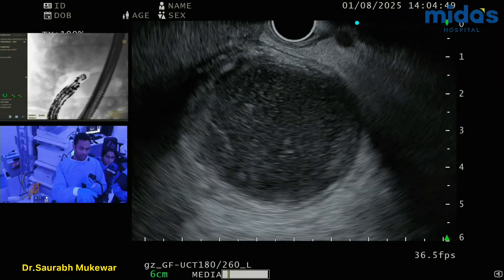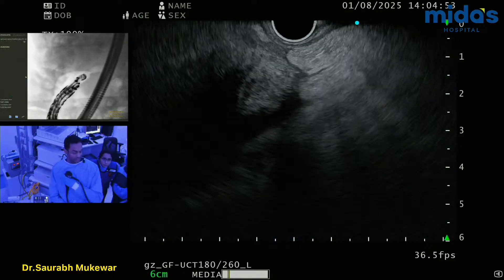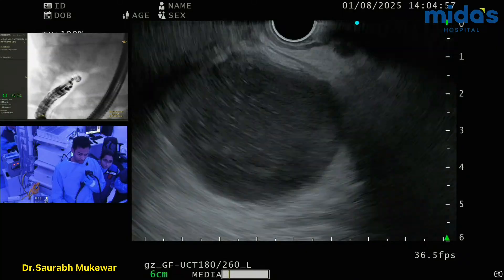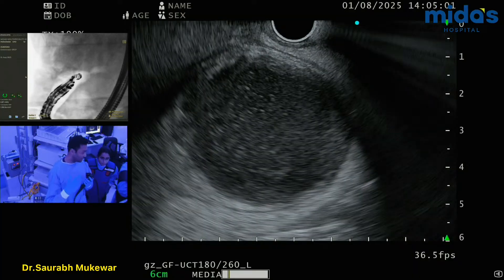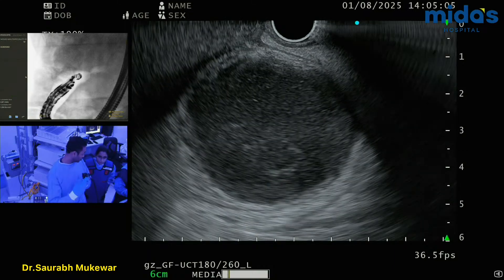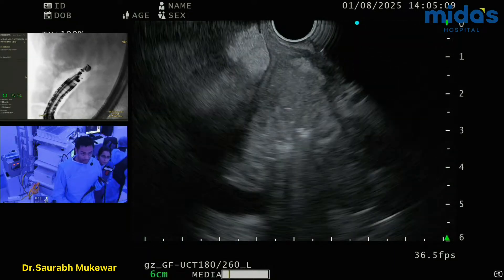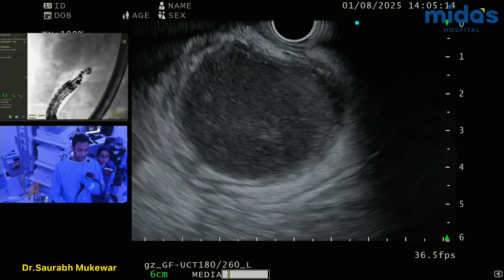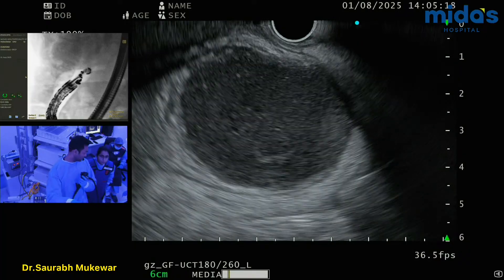So, antrum — the position looks fine. A few things to consider: what size of the stent do you use? That sort of depends on whether I have to remove stones, because if you have a large stone, you have to have adequate stent diameter — you have to do cholecystoscopy in future. In this particular case, I don't see any large stone. It's a lot of sludge, smaller stones if anything. And it's pretty bright, hyperechoic, which is suggestive of pus.